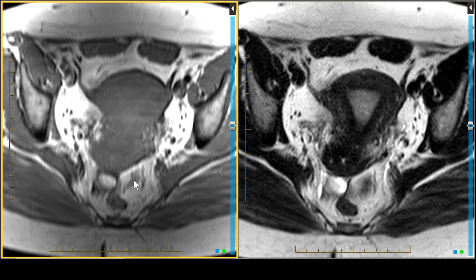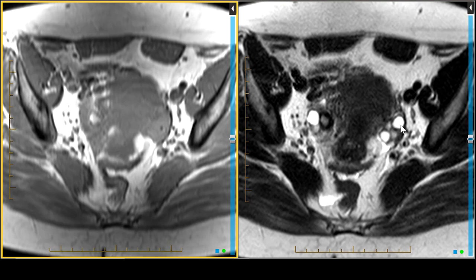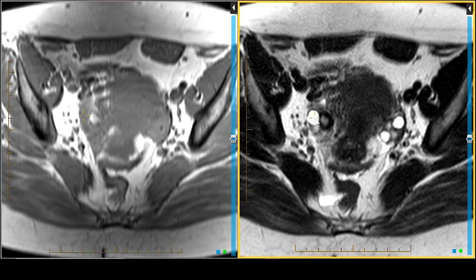From a hemorrhage, corpus luteal cyst, or you could postulate endometriosis, which this patient doesn't have. Now let's go back to the ovaries — we've got several high signal intensity foci on T2. We go over to the T1: are they pure CSF-like in character? No. Are they bright on T1? No. So they're proteinaceous cysts. Similarly, this one right here is a proteinaceous cyst — it's low but not as low as CSF, and high on T2. On the other hand, what about this one next to it — the one with this thick rim around it? That thick rim is a combination of siderotic change and fibrosis.